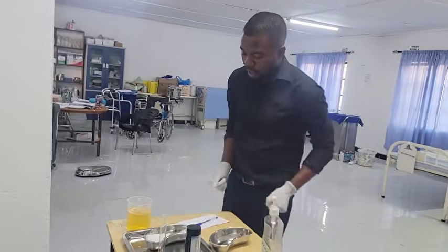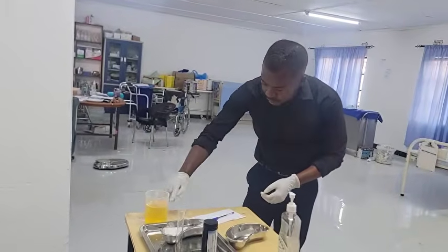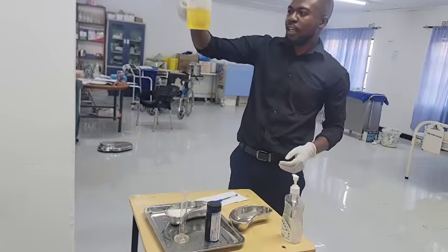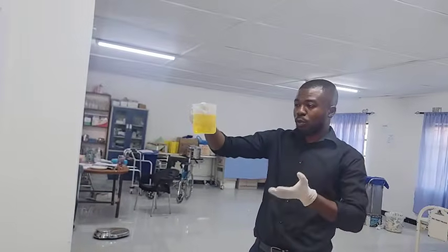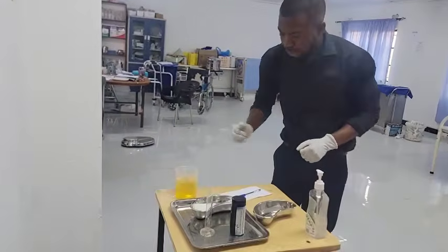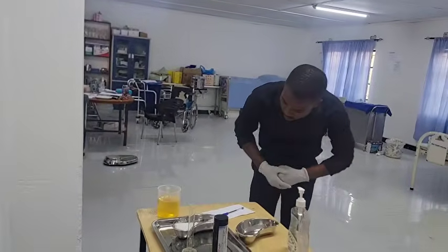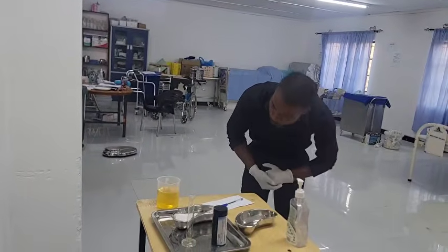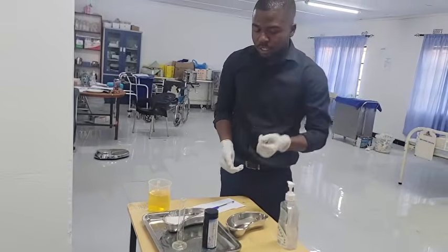Okay, so let's start with the amount of urine. Like I said in the first place, this jug has graduations. You don't have to lift the urine and start checking like this, because it's not going to be possible to get the correct reading. You need to put it on a flat surface like that, and then you just bend and see the graduations there. So the amount of urine is 400 mils. That's the first physical property.